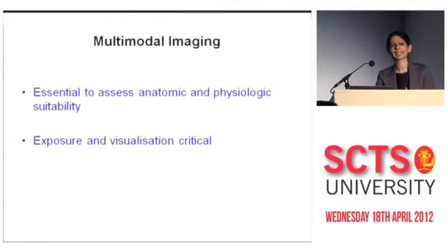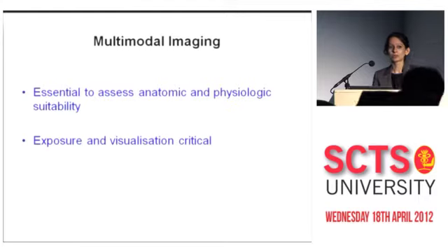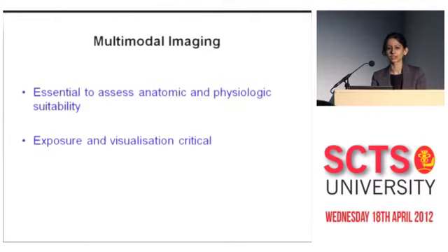One of the key ingredients that has emerged, and you've heard a nice talk this morning from Anita McNabb about the role of imaging and interventional in transcatheter strategies, is the multimodal imaging nature of this procedure. You will, of course, appreciate the importance of assessing the anatomic and physiological suitability of the patient for the therapy, and exposure and visualization is critical.